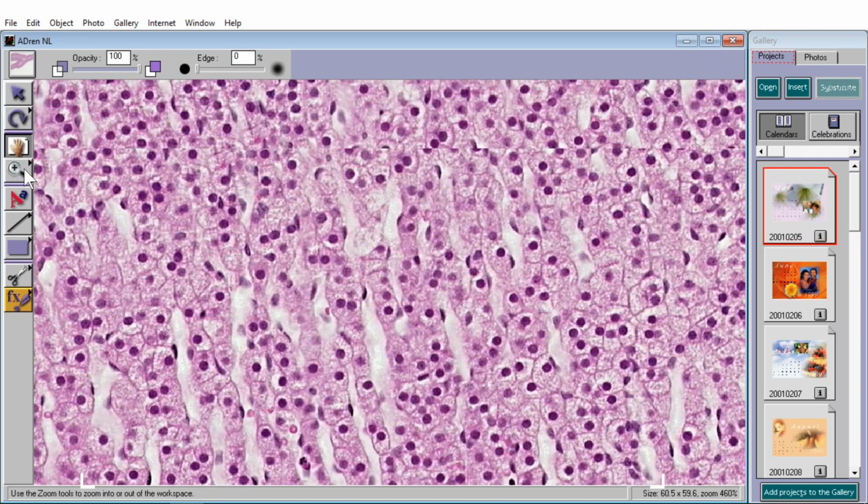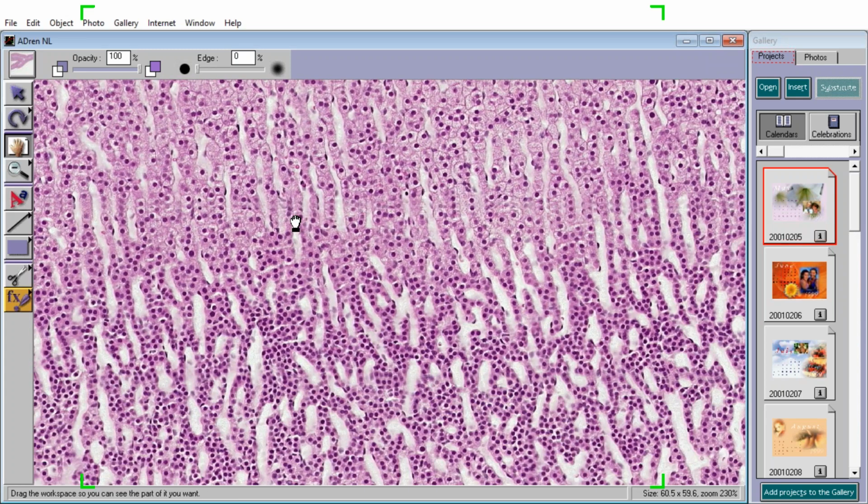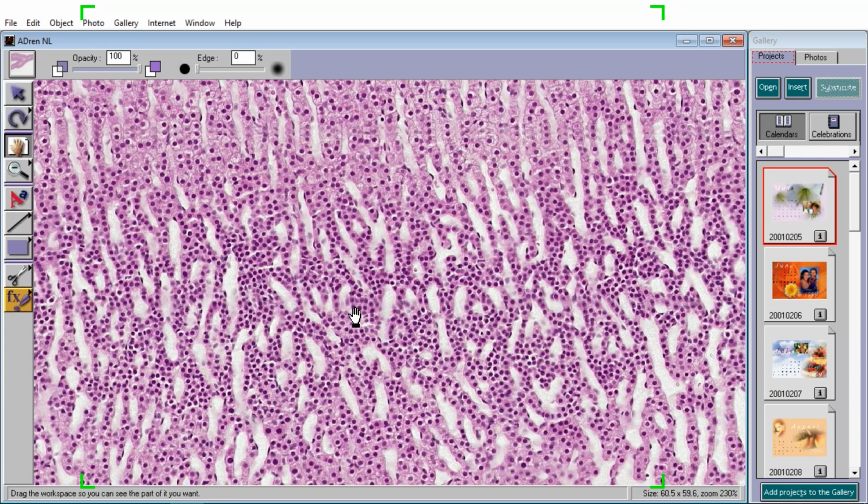And then, if we go a little bit further, we can go down to an area where the cells are arranged like little reticulations, like in a reticulated python. It has that network pattern. And this is the zona reticularis.